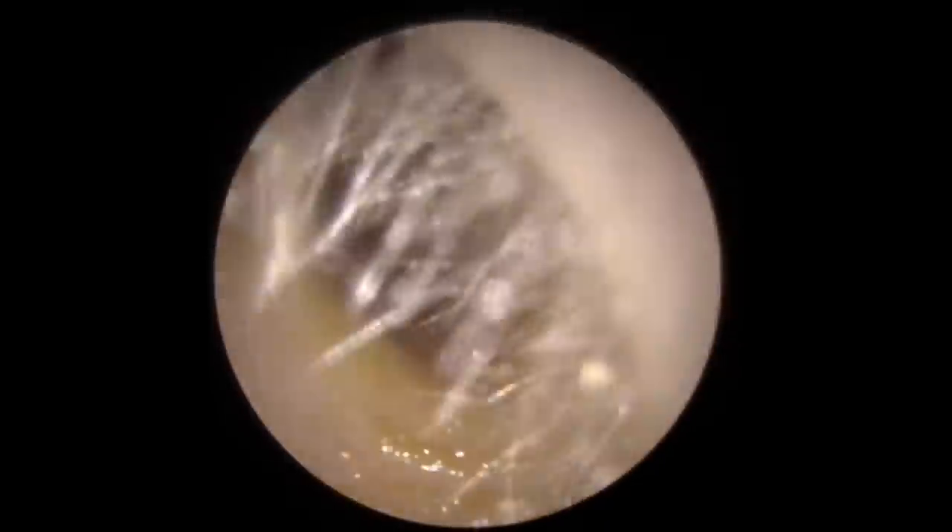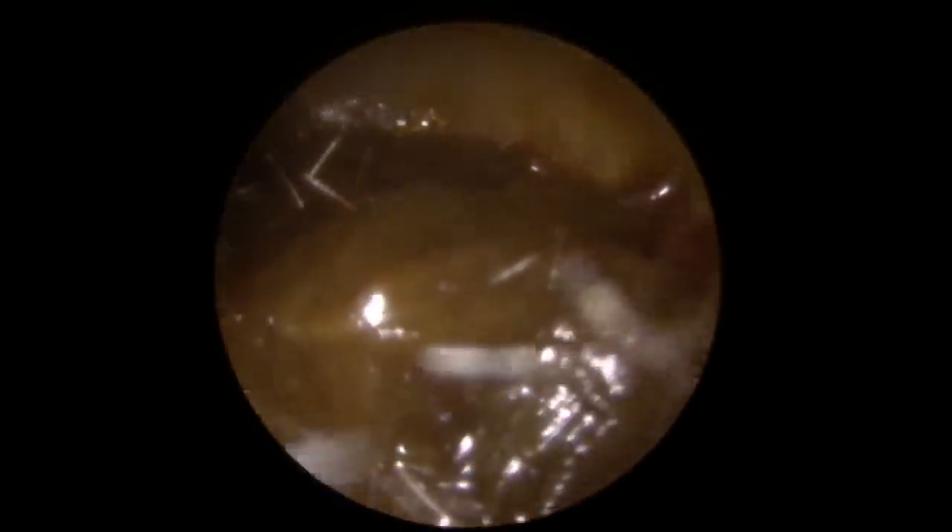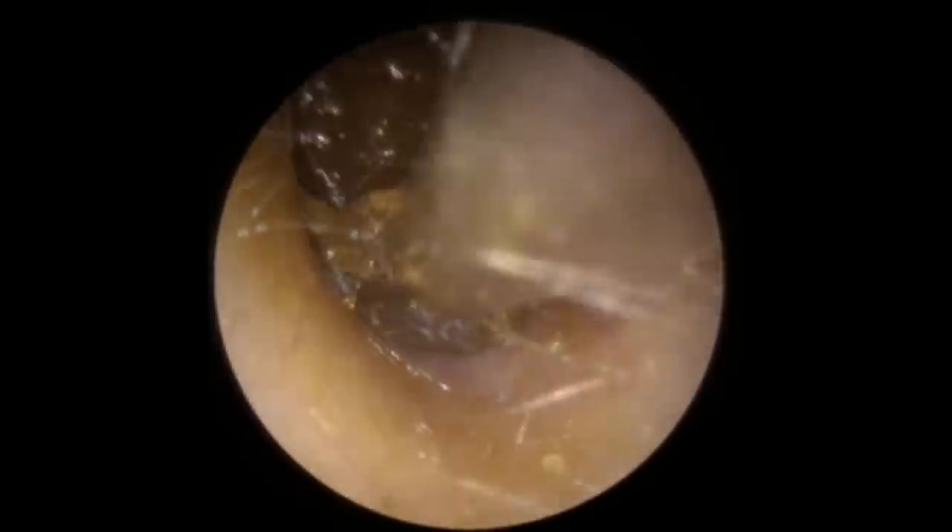Just to slow down the video a little bit so you can see. This is the second ear, same patient. You can see very soft wax in this side as well. Not so much of a gap, so the wax has been sort of stuck really close to the eardrum down there. Because there's a big gap at the top, we're going to still use the standard size Zollner tube — I think we'll get a good grip on this. So lifting it from the front end here, just trying to detach from the canal wall.